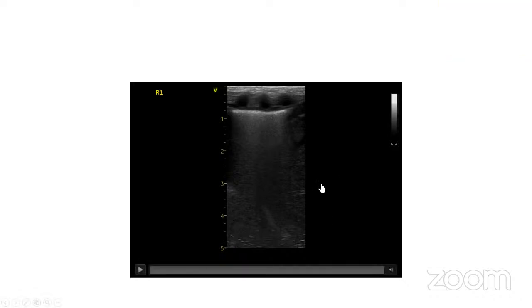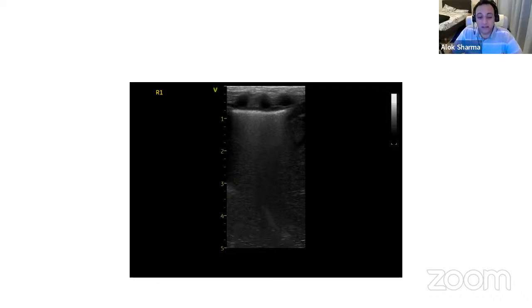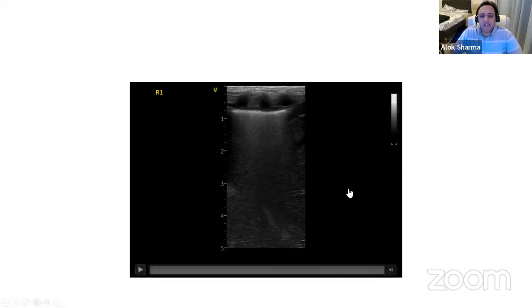Okay. My advice would be, I would use a higher frequency. What's the highest frequency you have? I think it is around 16 or 14. Okay, what I'd probably say is go to your highest frequency, bring it down until you've got a uniform appearance from 1 to 5. And my gut feeling is you probably settle around 12.